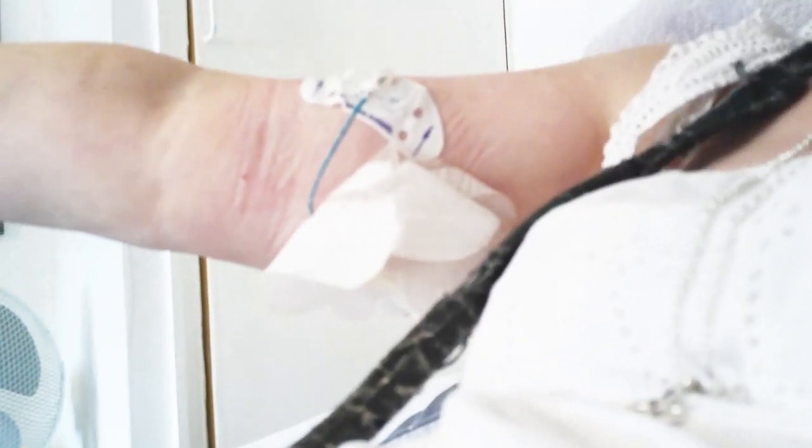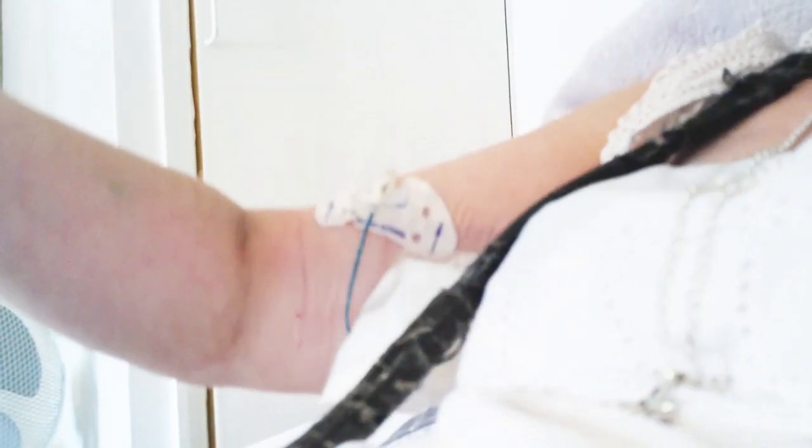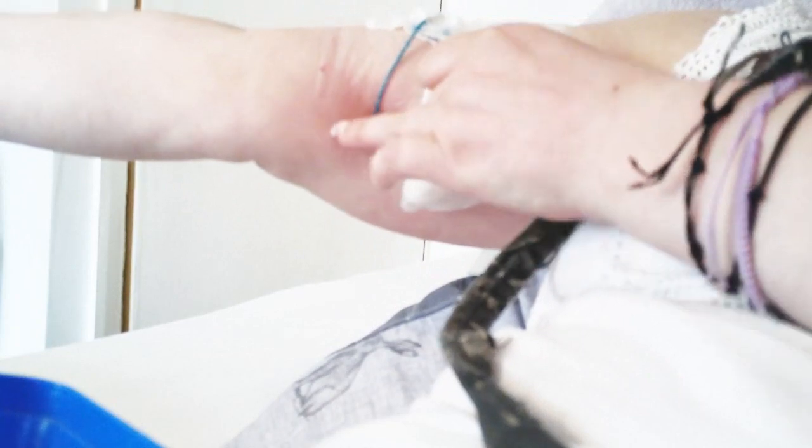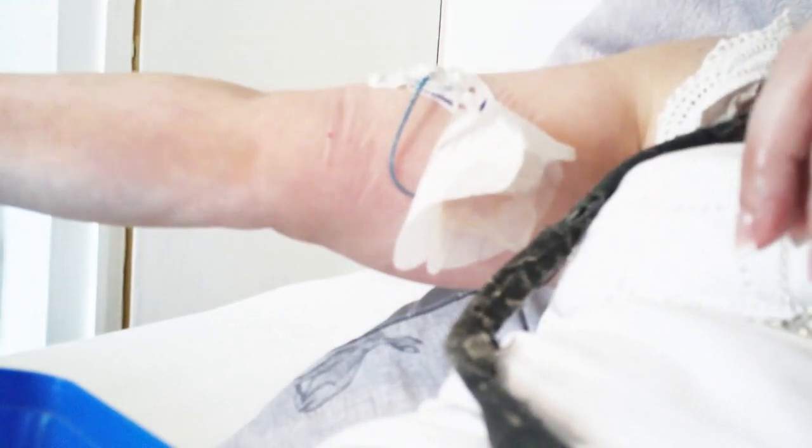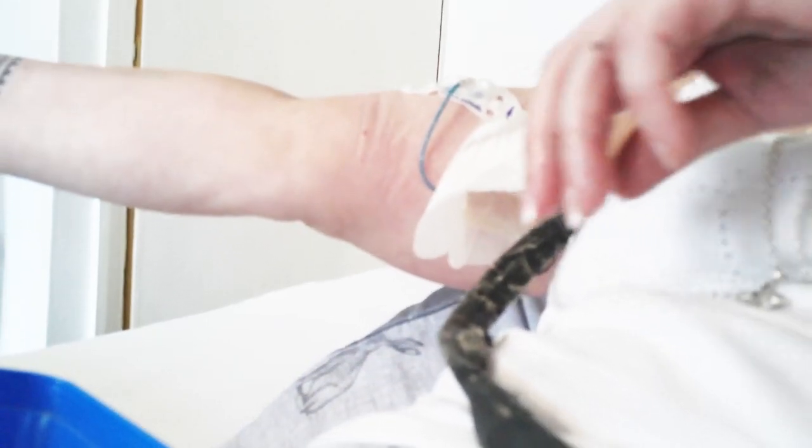And that's fine. Okay. More hand gel. Hand gel, hand gel and hand gel is the key. So I hold the Tegaderm here in this hand, so I've got it ready. I normally have my arm resting on something. While I do this, if I cover up the picture, it's just going to have to be what it is, because I need to concentrate on getting this dressing off. And again, more gel on the hands, but I'm still not going to touch the side of this.